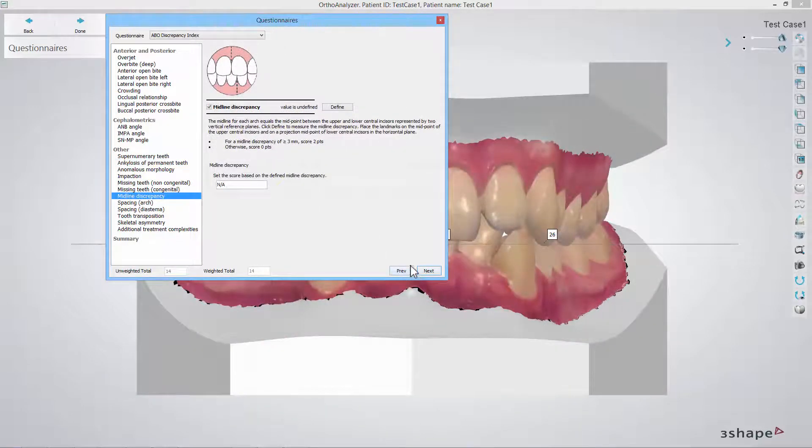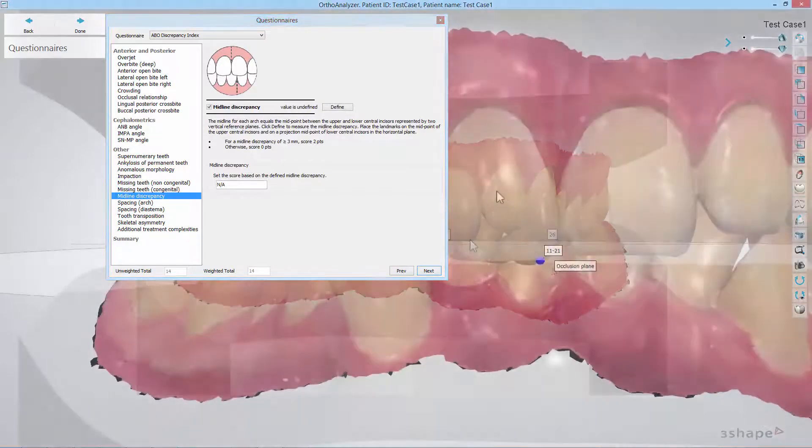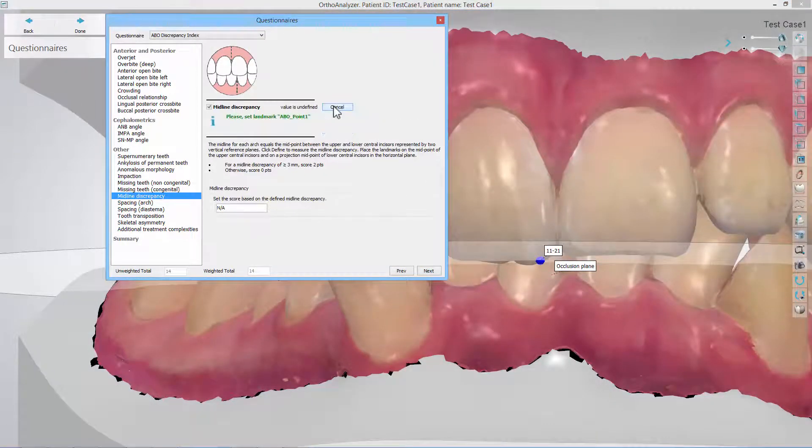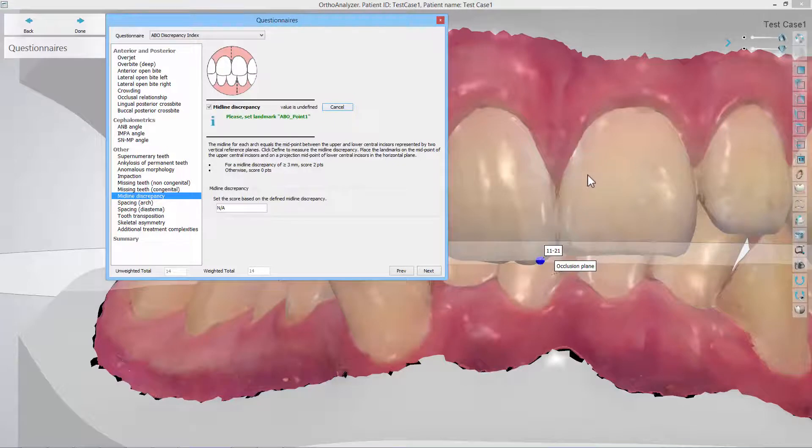In the midline discrepancy step place two landmarks on the same incisor to measure the distance between the midline of the upper jaw and the midline of the lower jaw.